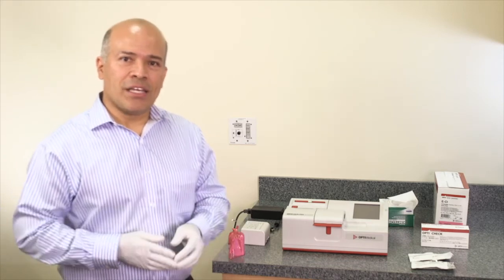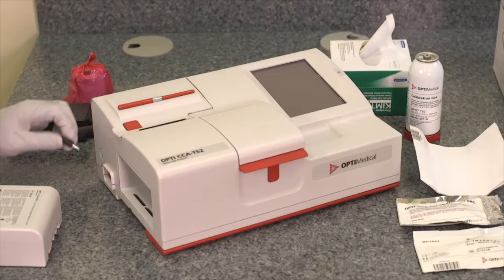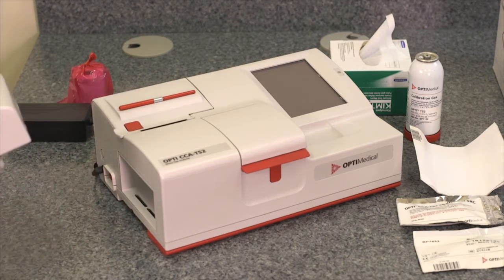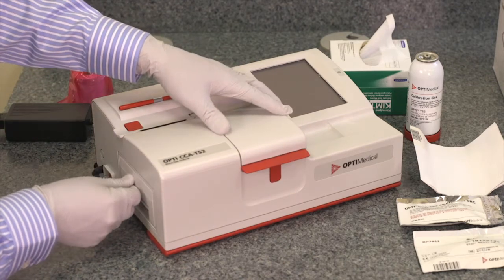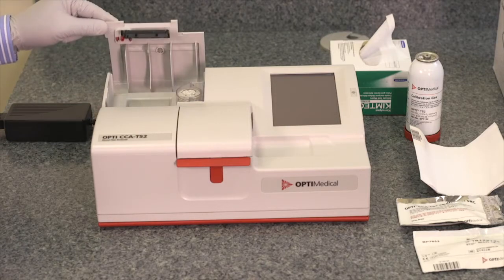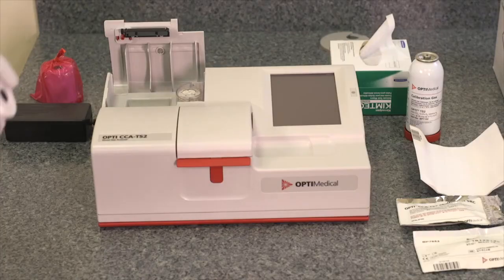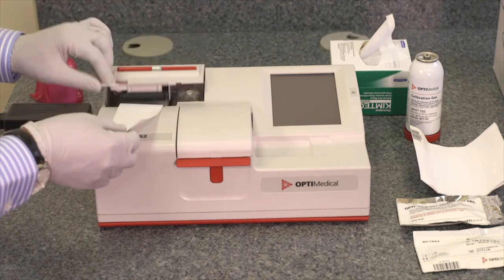This section covers the setup of the OptiCCA-TS2 analyzer. To turn on the analyzer, connect the power supply to the power supply adapter. The rechargeable battery has to be inserted into the battery receptacle. The printer paper is placed on the printer — to open the printer, press the red button. The Opti analyzer uses thermal paper; once the paper is placed, close the cover.